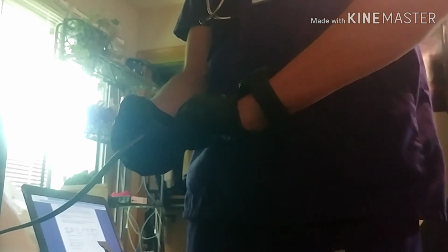So now I'm going to actually put the medication in. We're going to do another 15 seconds here. Okay. And with this medication, since it is 1 milliliter total in here now, I'm going to administer that over 1 minute. So, here we go. Alright, seems to be going well so far.